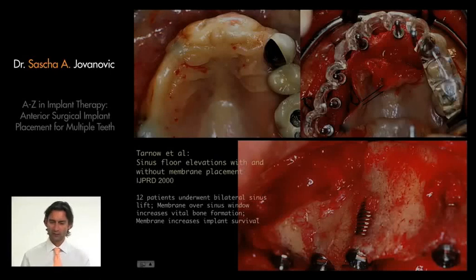And you can see that because you can see here 1 implant, lateral incisor, 2 implant, then a pontic. So the treatment plan is here: pontic, implant again, then a pontic, and then 3 implants in the back, because we need this for the functional forces which are applied here. So the only area where we still have a problem is between the lateral incisor and the center incisor, but here I just needed some more support to go across the curve.